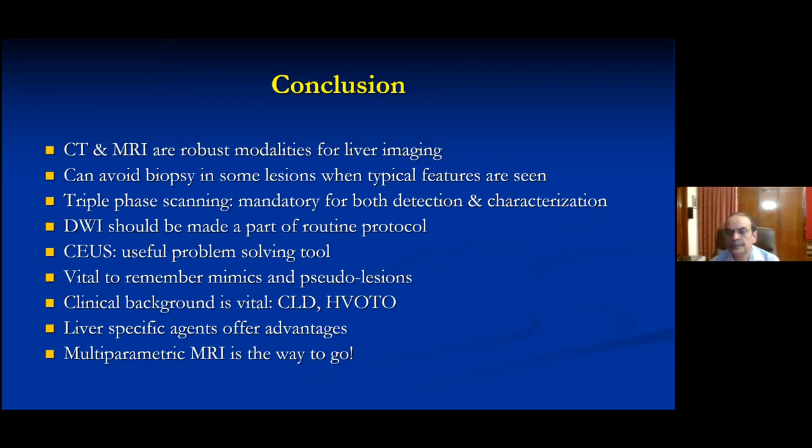There are a couple of questions on intrahepatic cholangiocarcinoma. One is Dr. Path Shah from Mumbai, who wants to know how it will be differentiated from hepatocellular carcinoma, while Dr. Avinash Tiwari from Srinagar wants to know how you would differentiate intrahepatic cholangiocarcinoma from cholangitic abscesses.